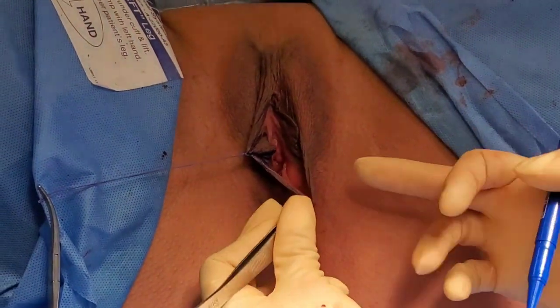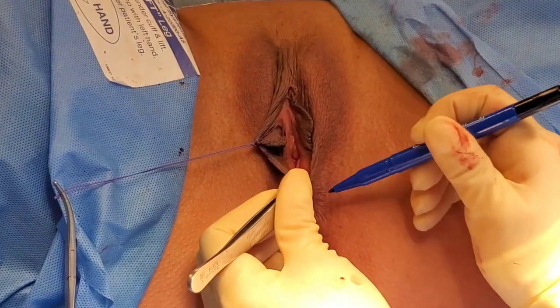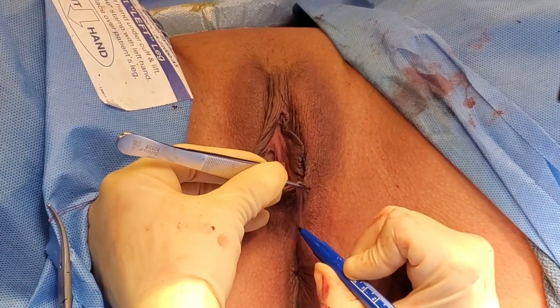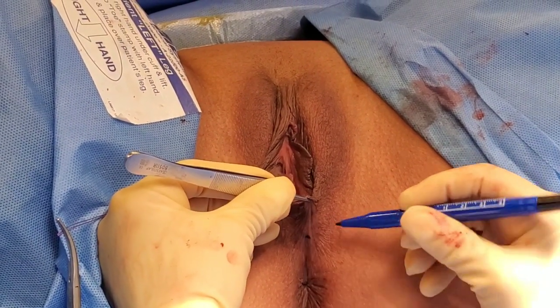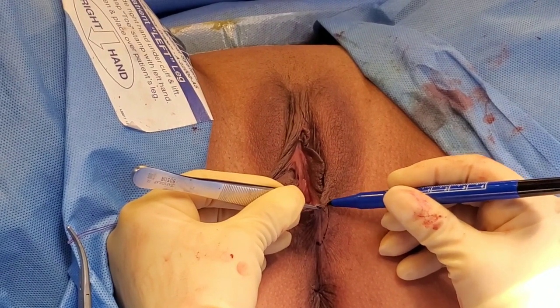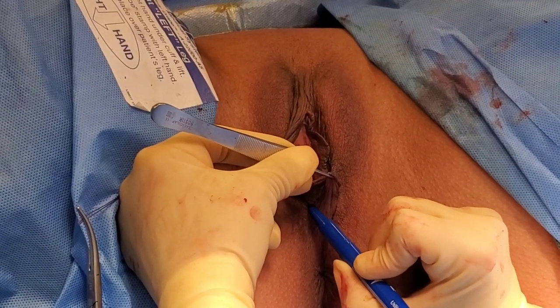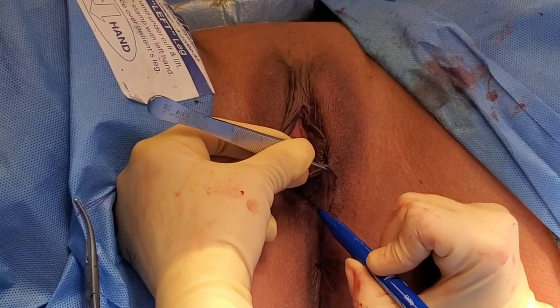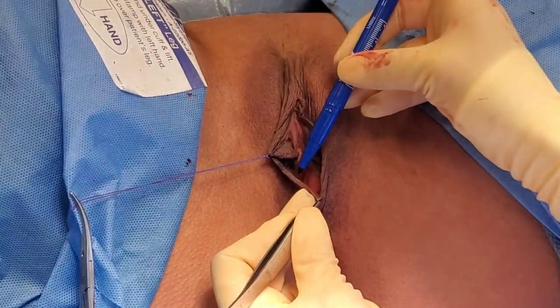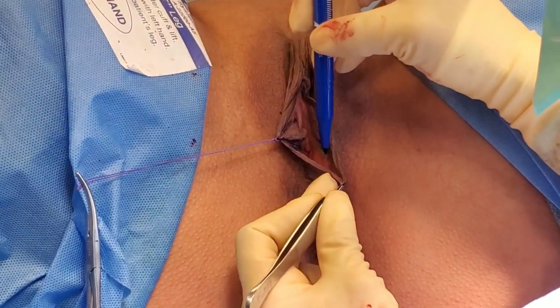This here I'm going to pull out this way because I want to eventually bring these two pieces together, so I need to mark this area. We're going to do a pinpoint in the middle and then fan out to the side. The one thing you don't want to do is cut out too much, because then the tissue ends up under a lot of tension and it may not heal as nicely as you want.